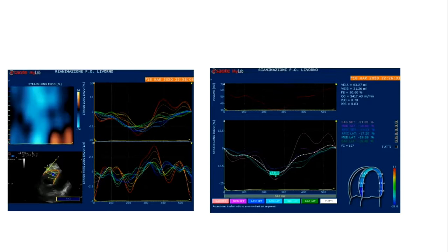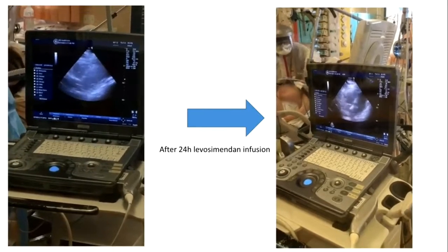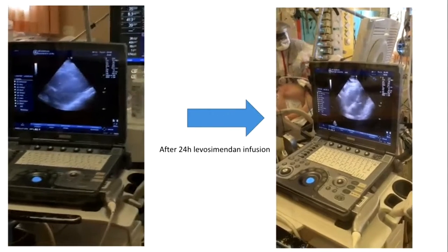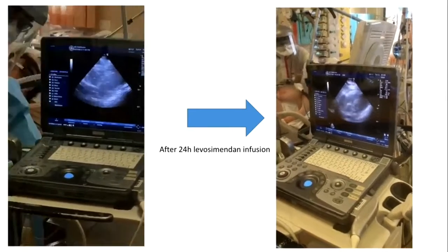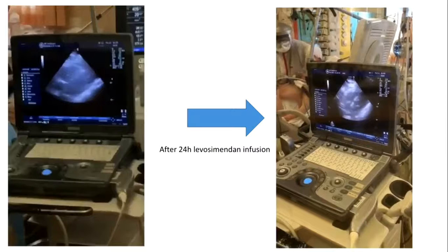This is very important because when you prone the patient with a right heart insufficiency, you will have hemodynamic instability, and you can have cardiac arrest. So in my opinion, the evaluation of the right heart function is important before proning the patient. You must be safe about the hemodynamic condition. Take care. We had a cardiac arrest after prone position, and so we learned about this situation.